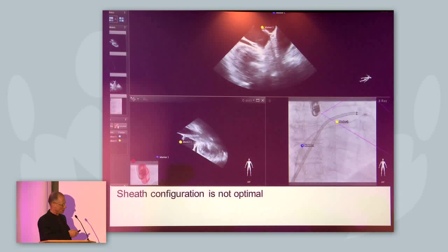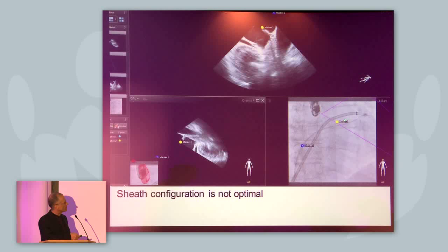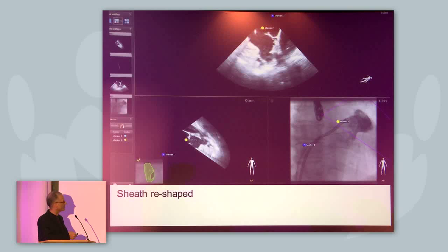We also use this for our technique to shape the catheter during deployment of devices. You can see the original configuration of the catheter placed outside on the chest of the patient. You can see the marker for the transseptal puncture, the pulmonary ridge, and the pigtail catheter — and you see that the configuration of this sheath for this particular anatomy is not optimal. So we change the configuration of the sheath, and now you can see that the sheath has a better position and orientation to the left atrial appendage.